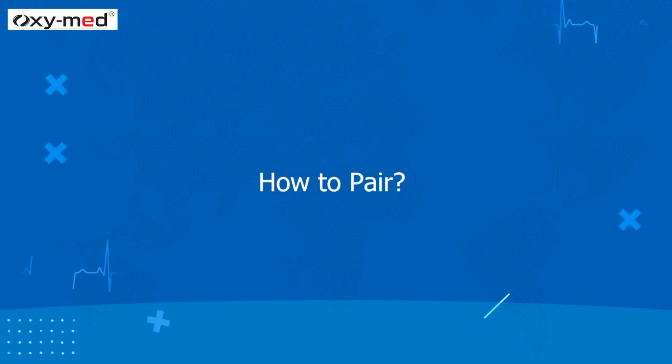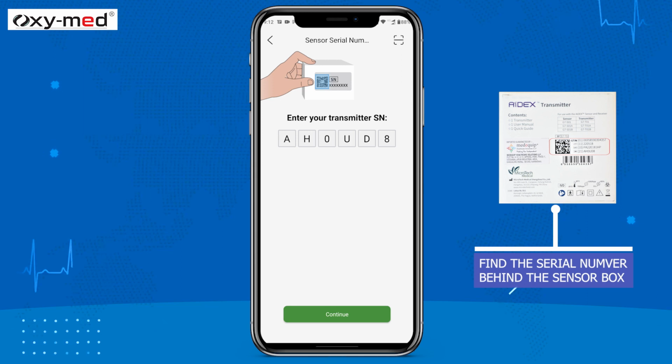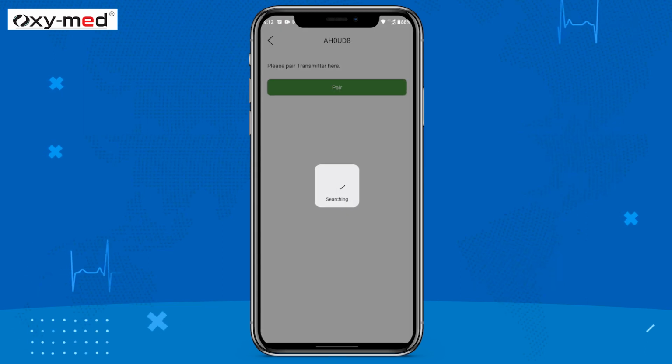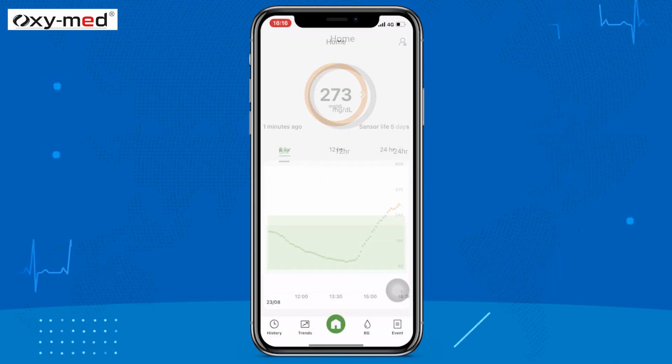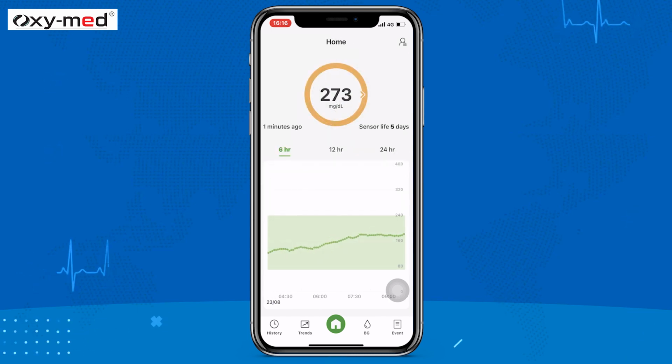Now let us see how to pair. To pair the device, enter the serial number printed on the transmitter. Confirm it is a new sensor on the device and then allow your sensor to warm up. Once the 1-hour warm-up completes, you will receive your first sensor glucose reading.